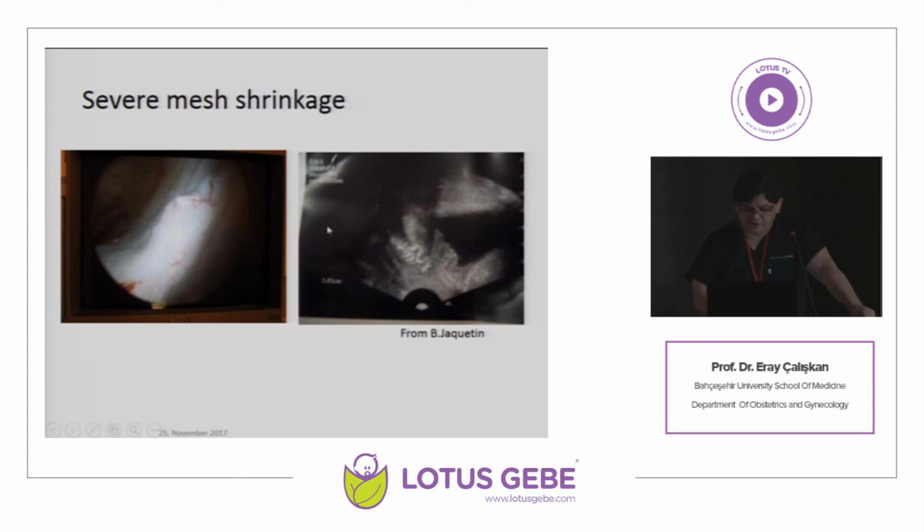Here is a severe mesh shrinkage. You can see that there is a kind of erosion here under the mucosa. There is the shrinkage of the mesh. This is a problem because this causes urgency in the patients.